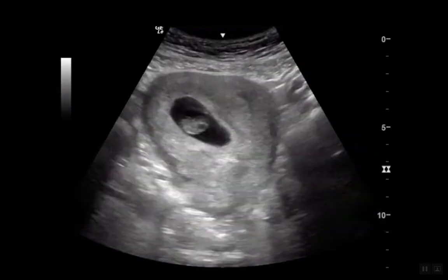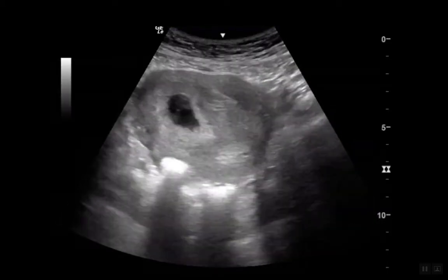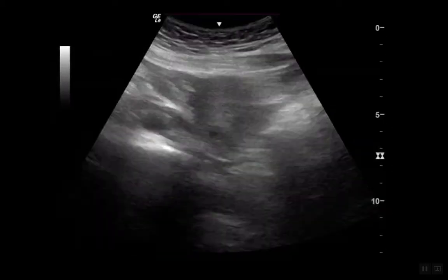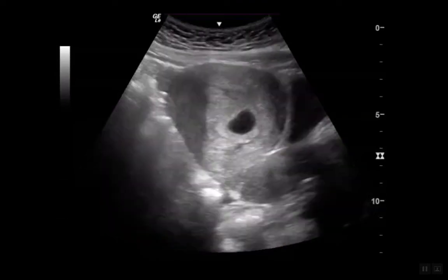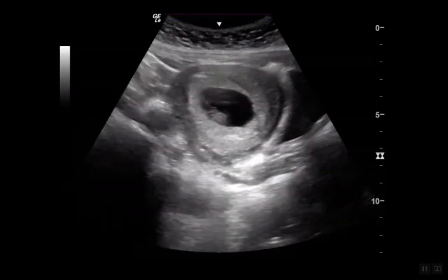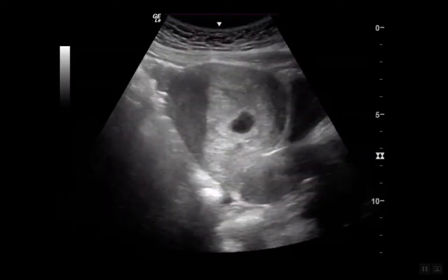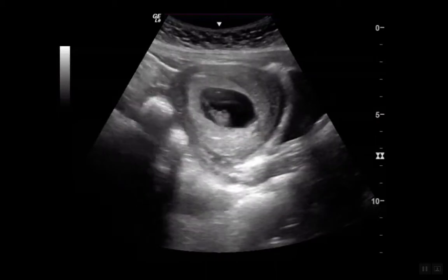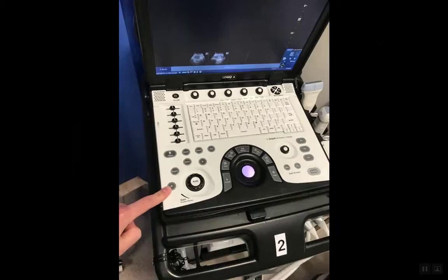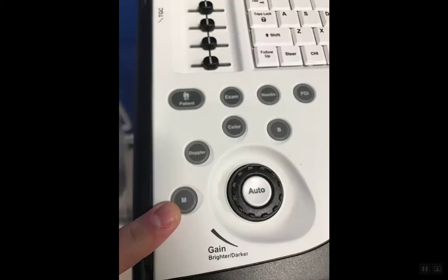The first thing you do with OB ultrasound is fan through looking for a pregnancy. Once you've done this, you then need to use M-Mode to find the fetal heart rate. That's using the M button down in the left lower corner — M stands for M-Mode and is next to the auto gain button.